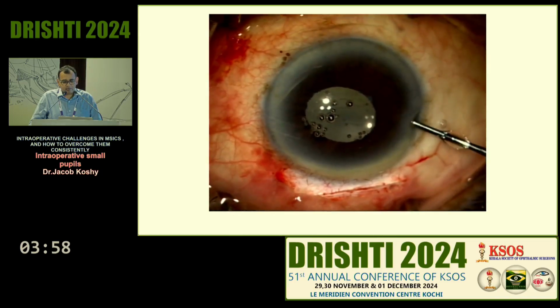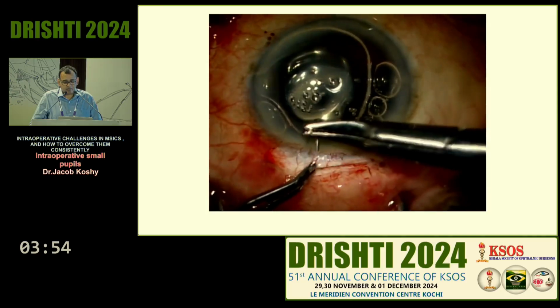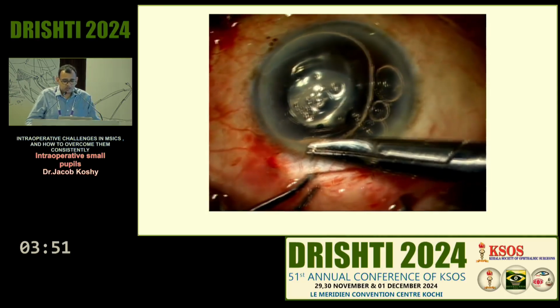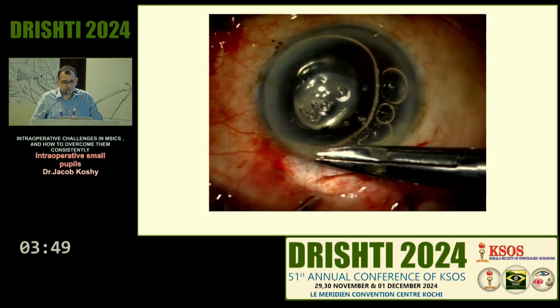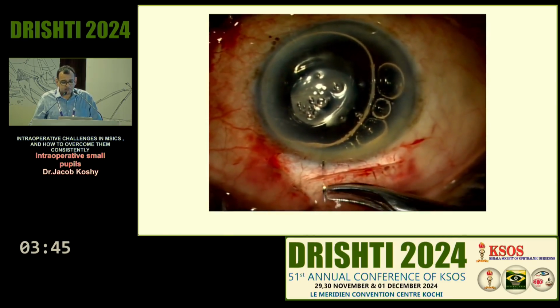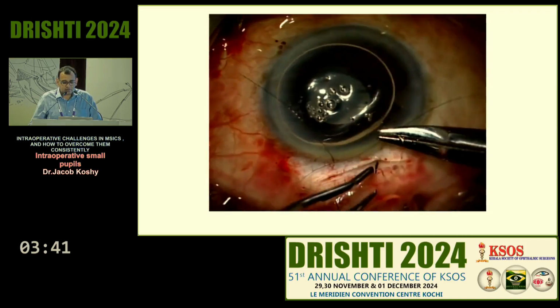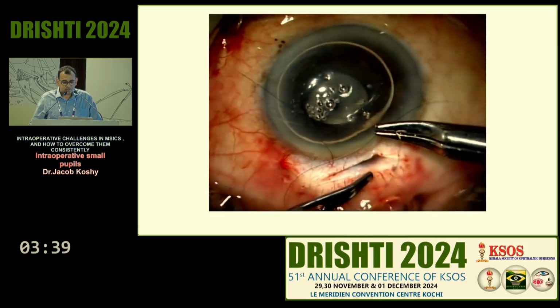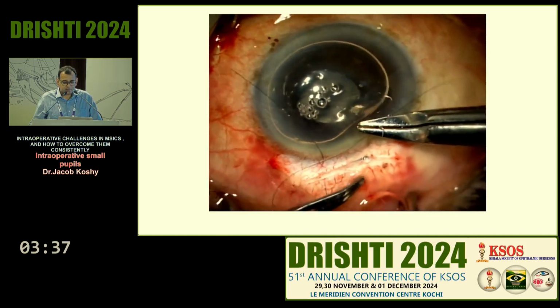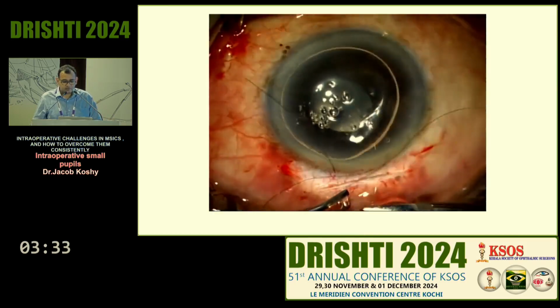Cleaning it up. Any patient you've done a vitrectomy, please remember to put in a suture. The last thing you want after all this is to try and go back because you have a leaky wound or a soft eye the first post-op day. So generally what I would do is I put a single cross suture for these cases. You can put a Fine's infinity suture if you know how to do that or you're comfortable with that.